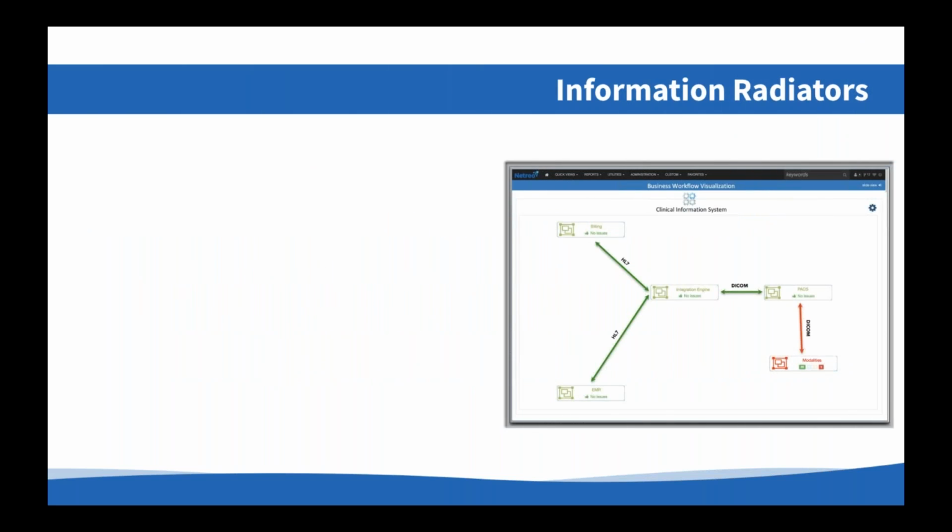An information radiator is really just a system designed to display important status information in a public area. So for example, a monitor on the wall of a hallway that everybody walks through. The team can display application views or more technical ones depending on the audience and what we exactly need to show them and what they're expecting to see.